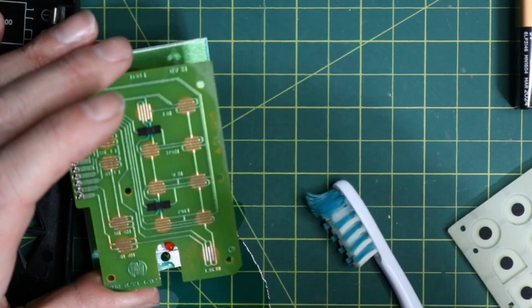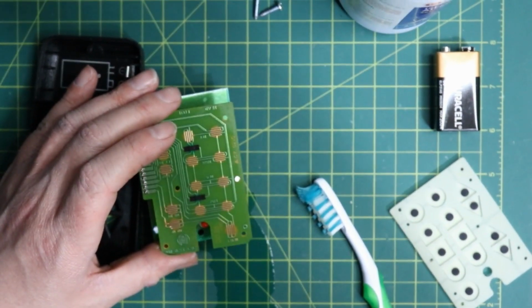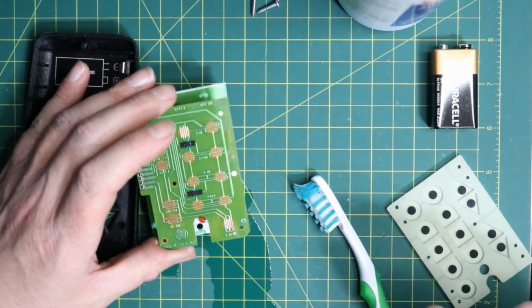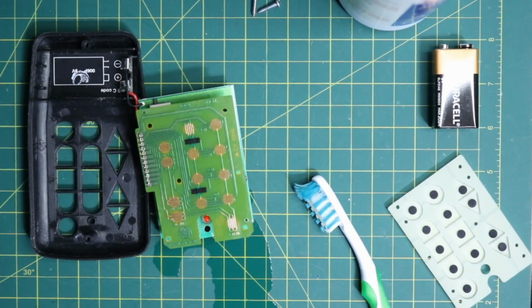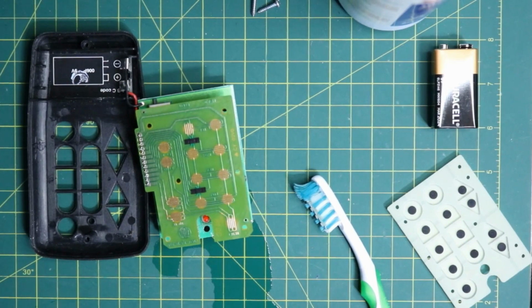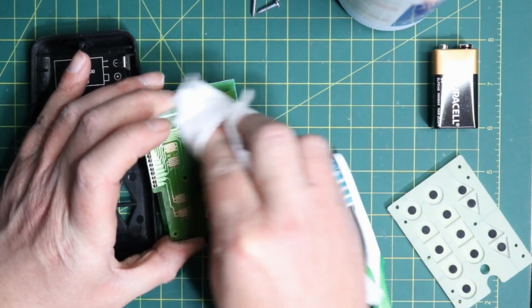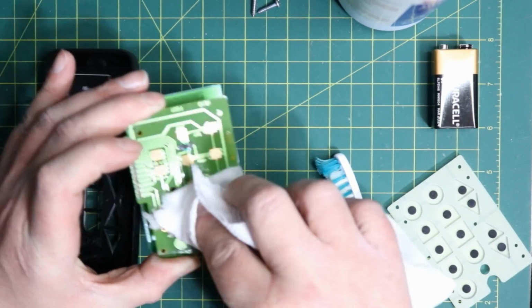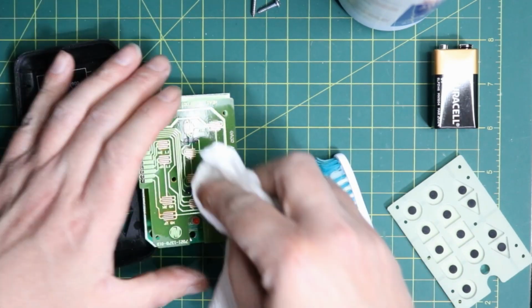you can probably see a little damage around this one down here, but unfortunately due to COVID, I've not been able to actually go into the person's place to test the controller and see what's going on for myself. So this is just me attempting to get this working for them just by visually inspecting it. And I cleaned it once before and it did work for 4 or 5 months, and then it came back to me, telling me there's something else that might be going on here. So it's going to happen, but I'm just going to wipe this all up here.